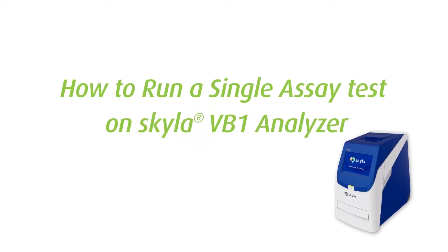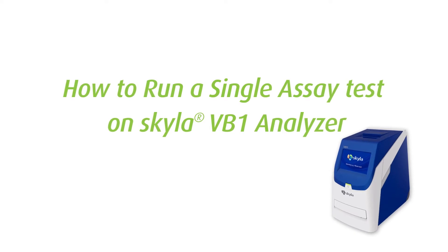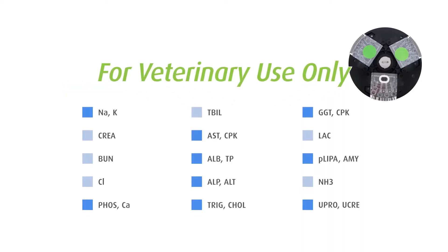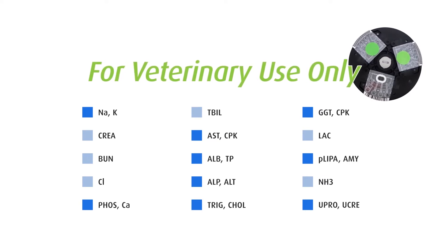This tutorial video shows the instructions on how to run veterinary chemistry test items on the skyla VB1 Analyzer, including the following single assay and dual assay tests.